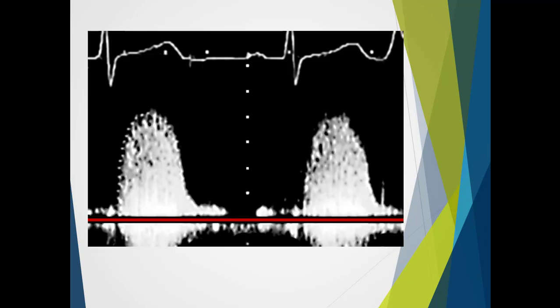This particular Doppler tracing we've taken from the apical window. It's a downward-facing one. With this we want to trace the leading edge velocity, so the very outer edge. We're not concerned about the number of blood cells that make the signal. We want to capture the blood cells that are moving at the highest velocity. In this particular one here, we've got an upward profile, so this is being taken from a right parasternal window. Typically, we'll find that the right parasternal window offers the best approach to give us the best velocities, so it's definitely one that must be considered as part of the standard exam.